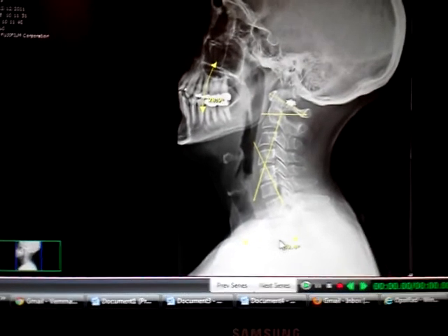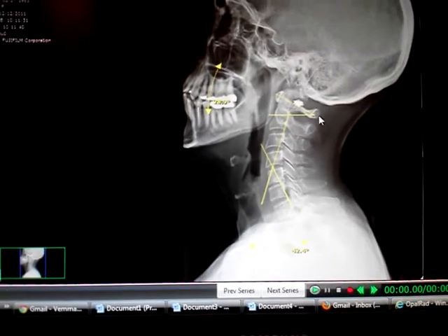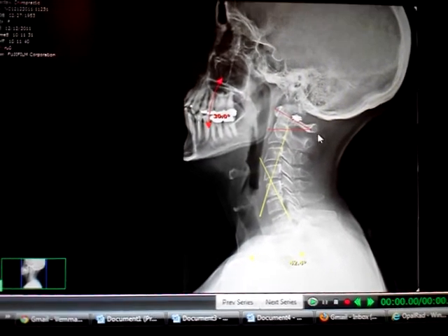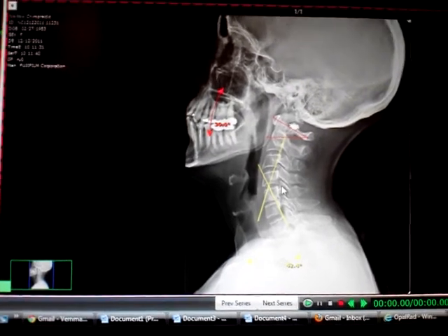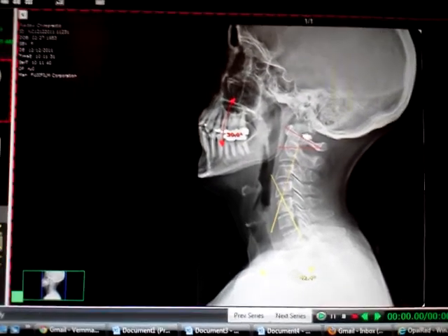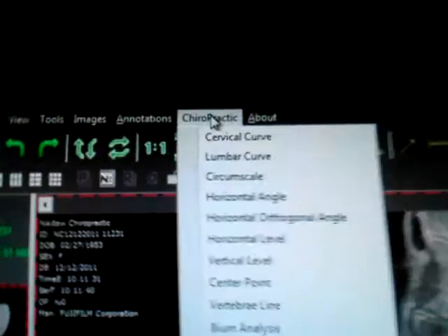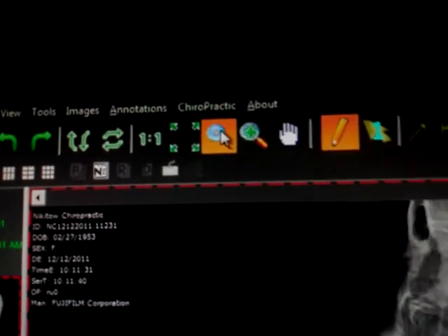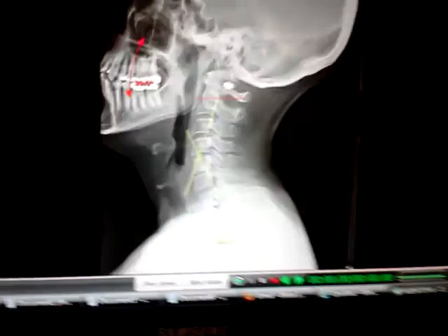This particular spine is looking to be almost perfect. For the next measurement, go up to the chiropractic tool, and go down to the first option there — cervical curve.